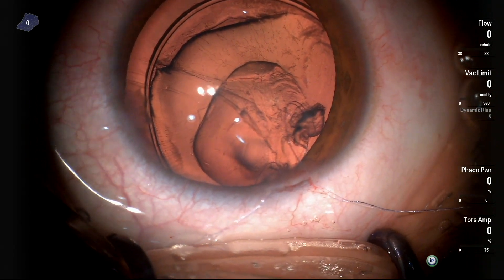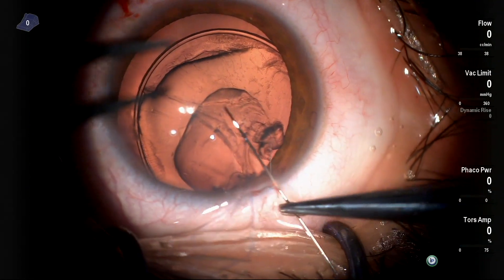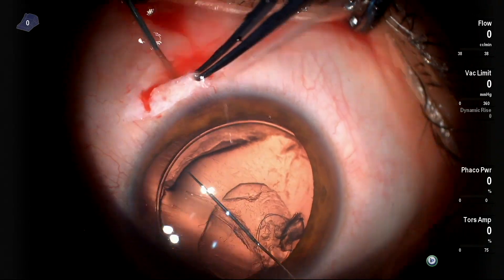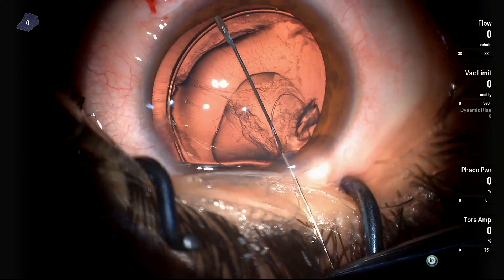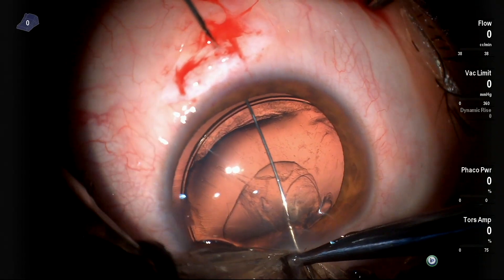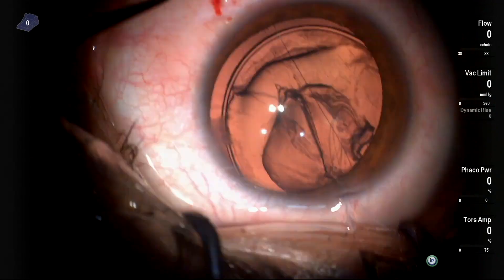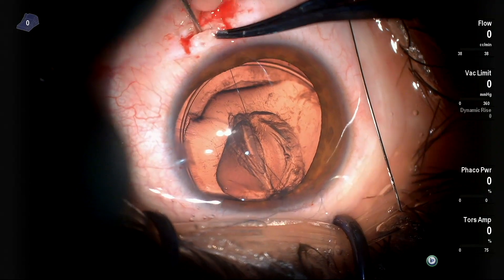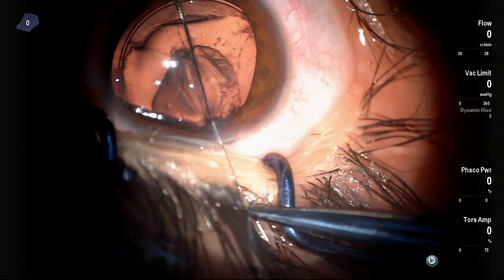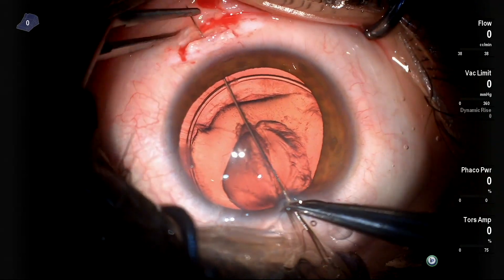You have to separate both threads — the proximal and the distal. Then you take the distal CTR thread, which is on the right now, and insert the straight needle throughout the eye, going outside using the handshake technique with the insulin syringe beneath the scleral pocket or scleral flap. It is important to emphasize that the needle should not pierce the capsular rhexis or you will compromise the whole surgery. Then the other end of the same thread is inserted and externalized through this pocket.